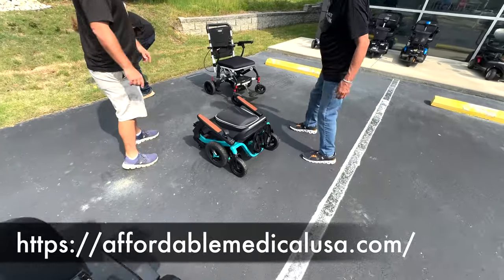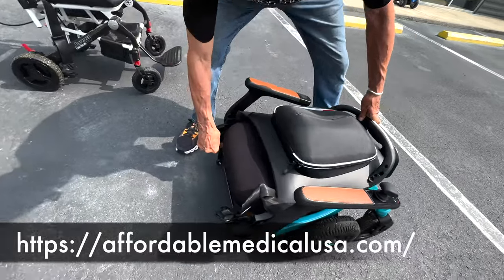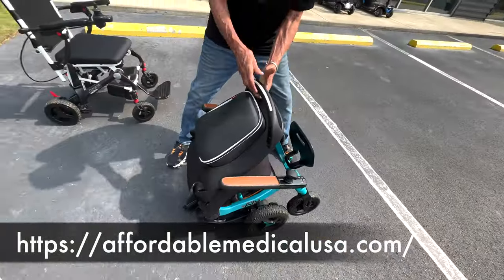This one, unfold it, remember how to do that? Yeah, push this guy down. Push down, yep. Push down, and then lift straight up.